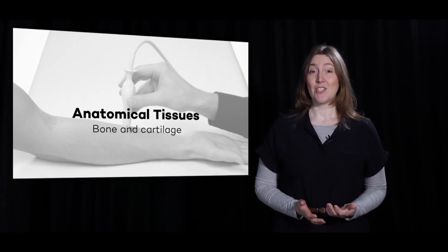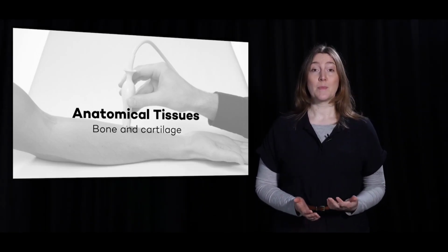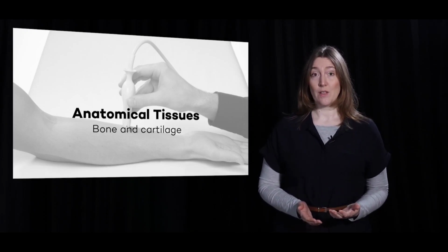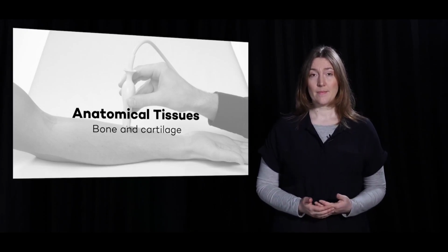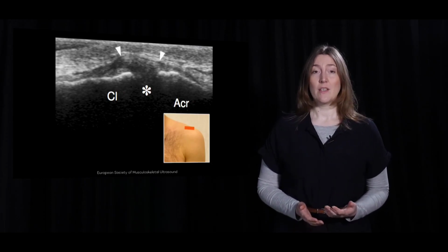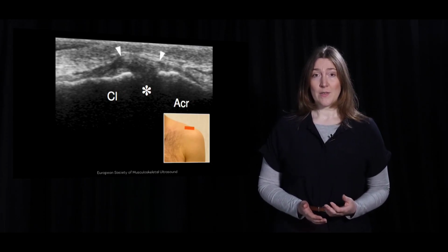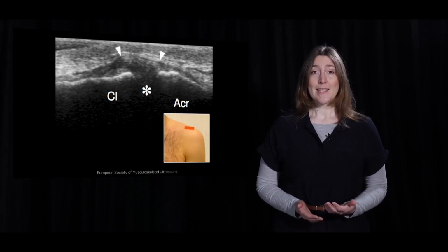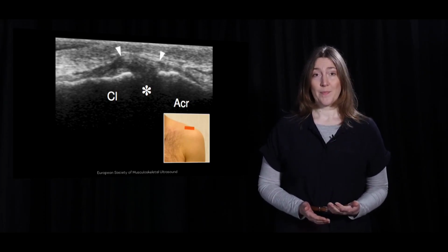The goal of this presentation is understanding how to recognise bone and cartilage, their specific characteristics when scanning with ultrasound. As discussed in a previous presentation, musculoskeletal ultrasound is not the gold standard to assess bone. The gold standard is still a simple X-ray.